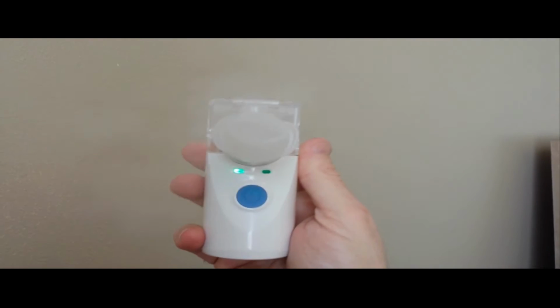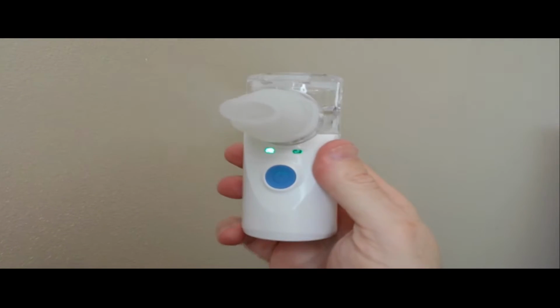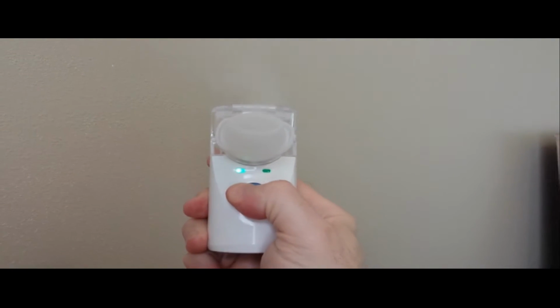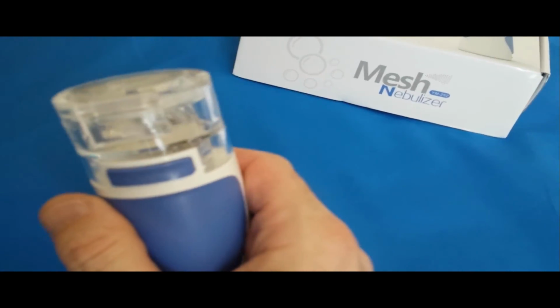Okay. But yeah, that's it operating here. And just put it up to your mouth and kind of inhale the formula. To turn it off, you press the button again. Okay. For cleaning purposes, the clear plastic piece on the top can be removed.